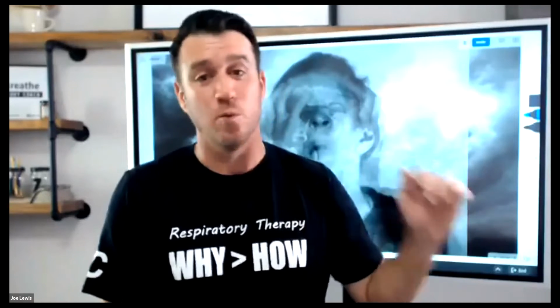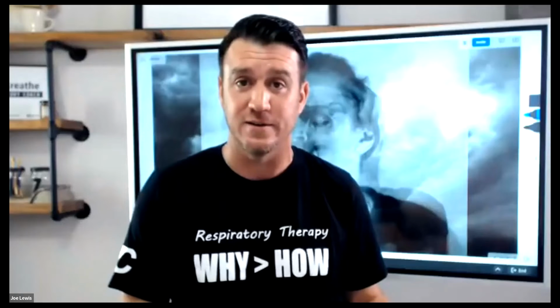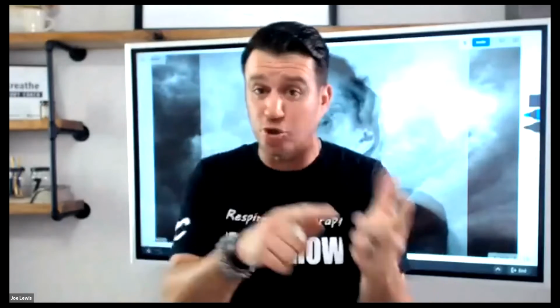Now, this shows up in a lot of different places also. So let's say, okay, P100 is cool, Joe, but take it out of the equation. Fine. You don't really need it, because you can assess neural drive to breathe also by monitoring waveforms and loops. And what you'll find is various types of asynchronies, ranging from trigger asynchronies. Remember, trigger is what starts the mechanical breath.